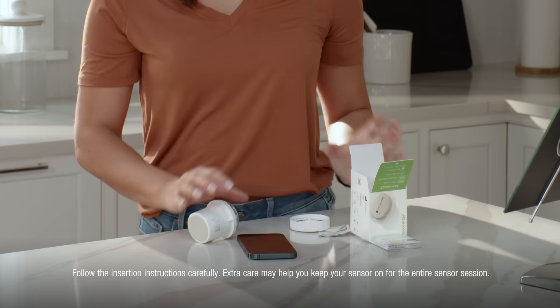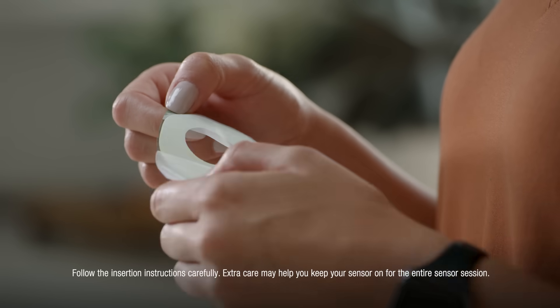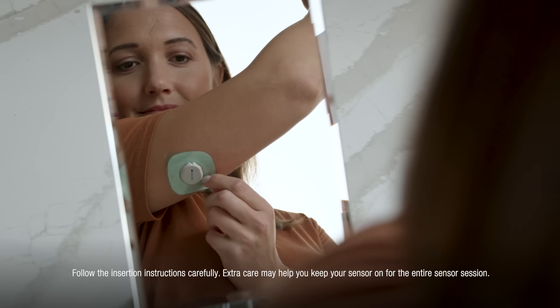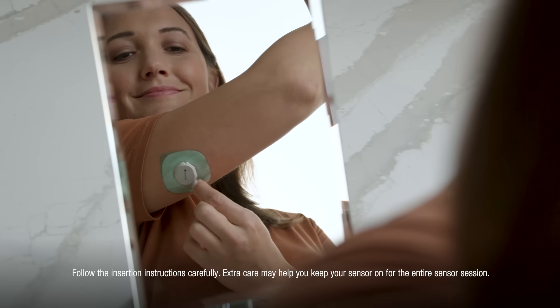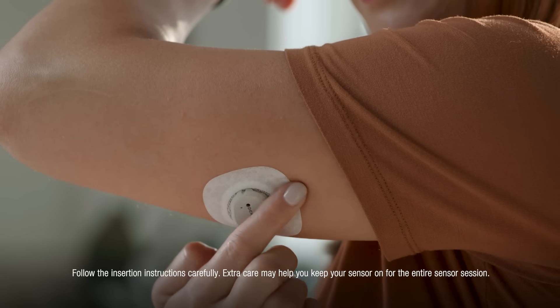Your overpatch will help you keep the sensor on and is bundled with your instructions in the box. Carefully pull off the clear liners one at a time — please don't touch the white adhesive area. Use the colored tab to place the overpatch around the sensor; you may need to look in a mirror for this part. Rub around the overpatch, then use the tab to peel off the colored liner, and rub around the overpatch again. Your sensor and overpatch are now complete.